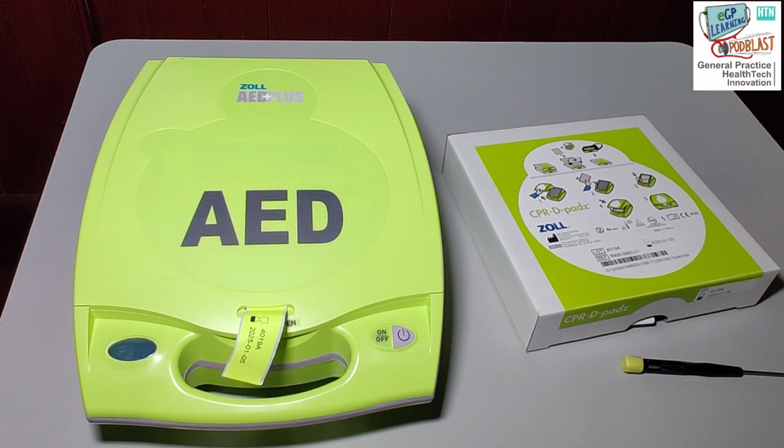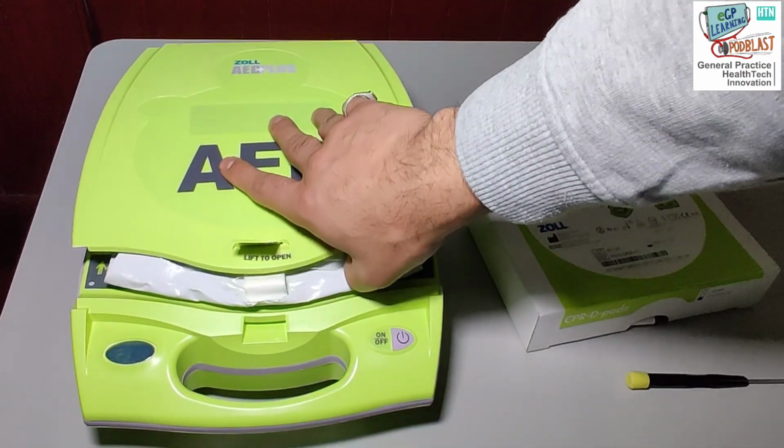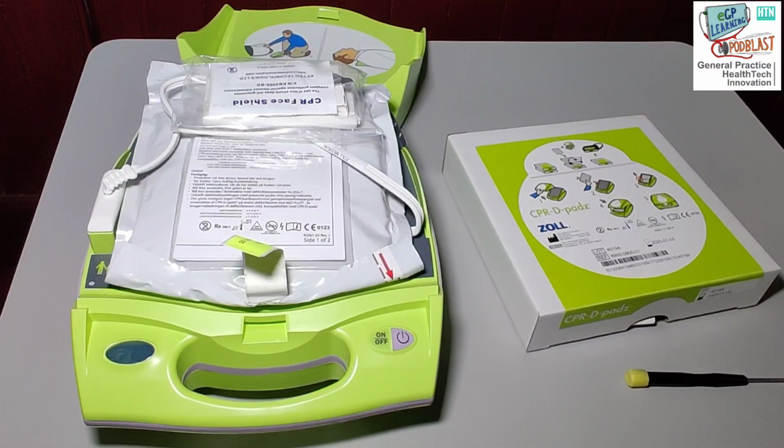Next, you'll need to insert the pads. In order to do so, simply lift at the front of the device and the lid will come off. As you can see, I've already inserted our pads because this is a functioning device.